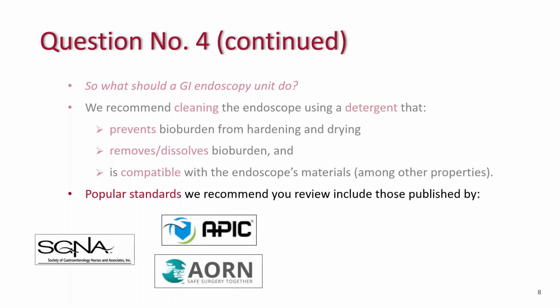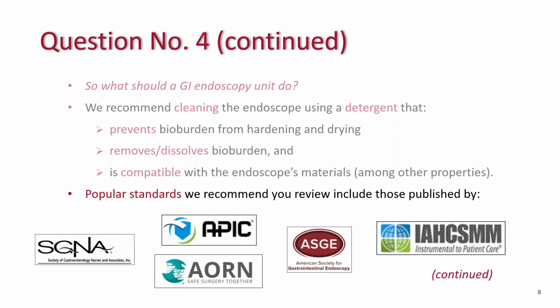Here are some popular standards we'd like you to review periodically and as often as possible to stay up to date and to assure complete understanding of endoscope reprocessing and infection control practices. There are some other guidelines out there, but when Ron and I designed this presentation, we thought we would bring these particular ones to your attention.